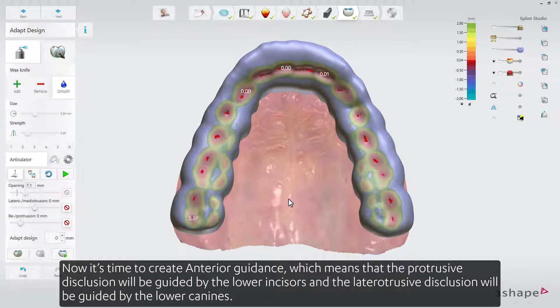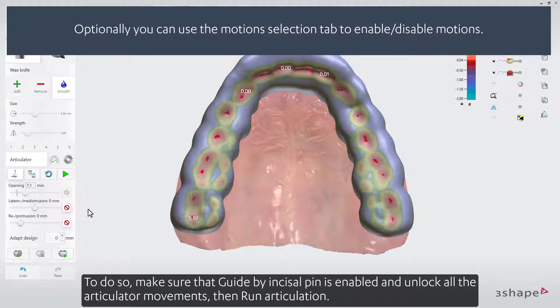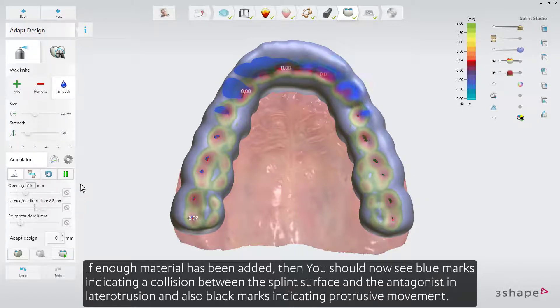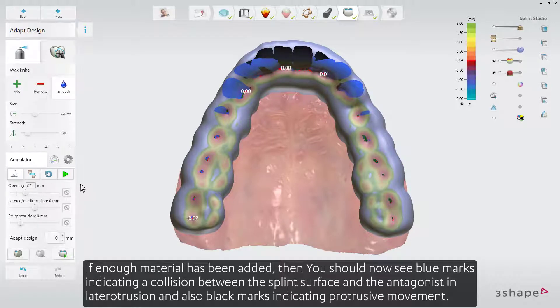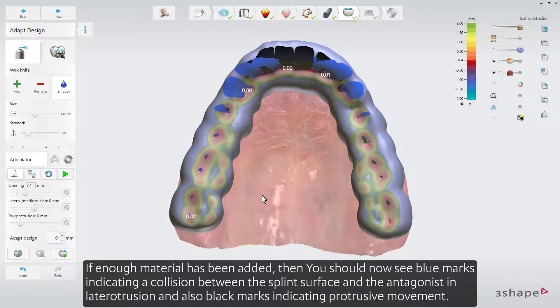Now it's time to create anterior guidance, which means that the protrusive disclusion will be guided by the lower incisors, and the lateraltrusive disclusion will be guided by the lower canines. To do so, make sure that Guide by Incisal Pin is enabled, and unlock all the articulator movements. Then run Articulation. If enough material has been added, you should now see blue marks indicating a collision between the splint surface and the antagonist in lateraltrusion, and also black marks indicating protrusive movement.